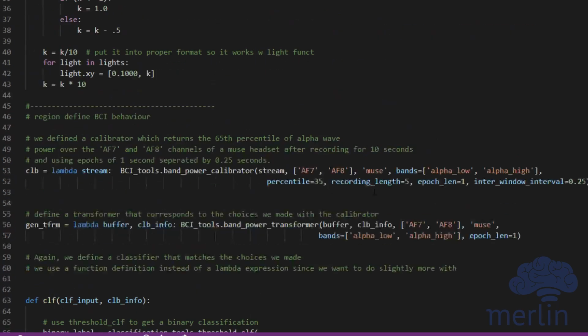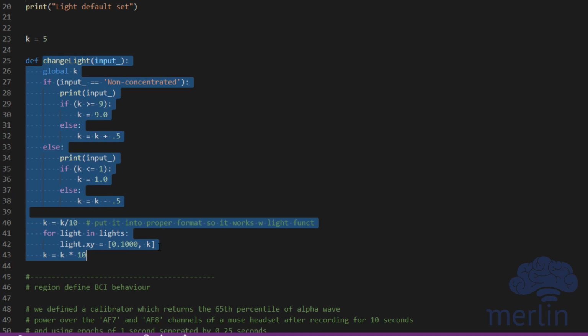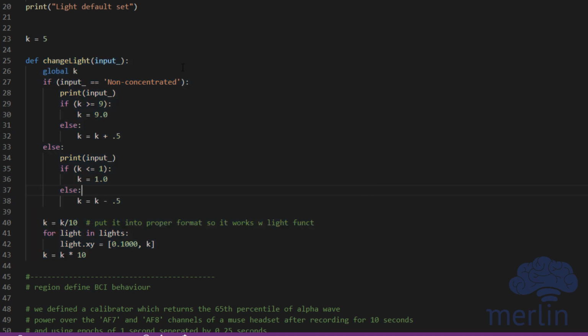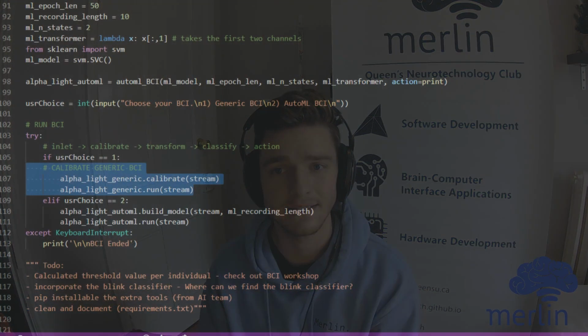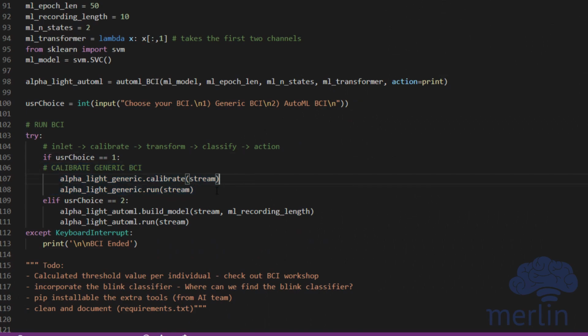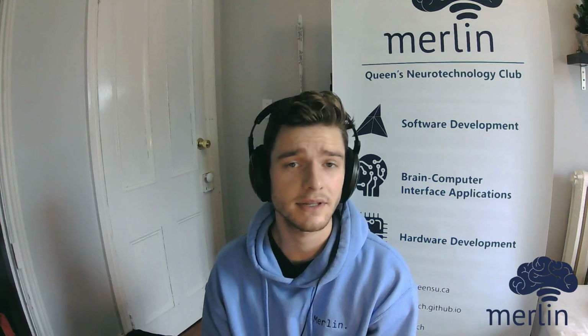Action. Takes the output of either not concentrated or concentrated from the classifier. If it's concentrated, you make the light more blue. If it's less concentrated, you make the light more green. After adding these functions in as parameters to create a BCI class instance, we can execute the run method and pass in the LSL stream object into the line of code. The outcome looks like this.